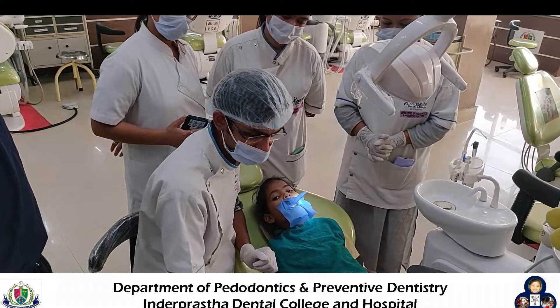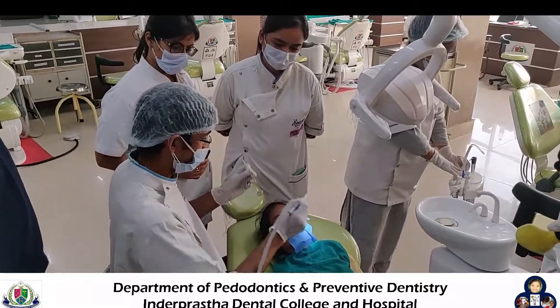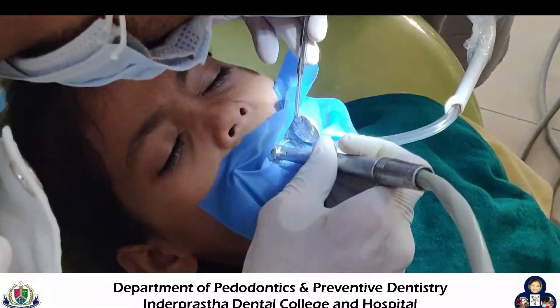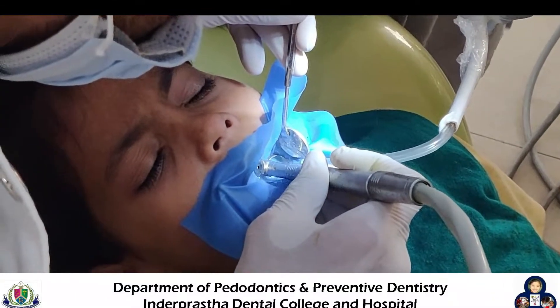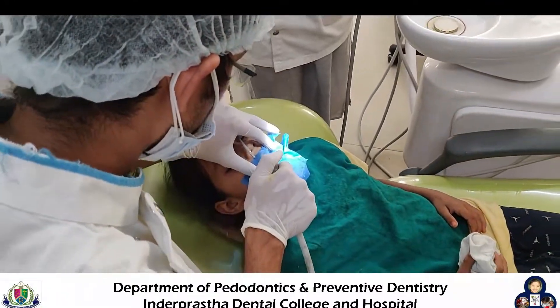Now we start with the cavity preparation. An ideal cavity is prepared over the tooth surface. After preparation of this ideal cavity, the surface of the cavity is properly washed and dried.